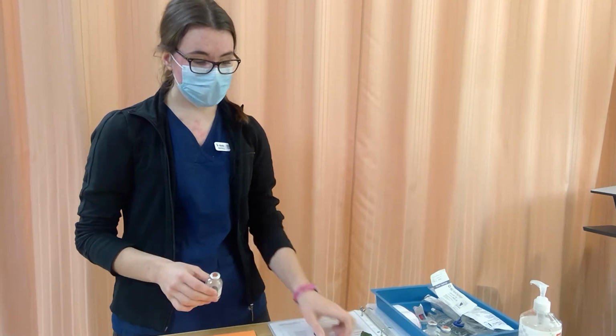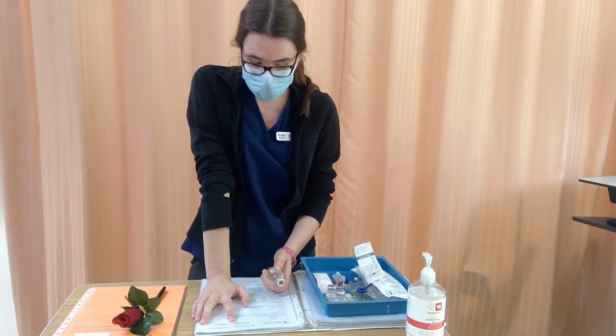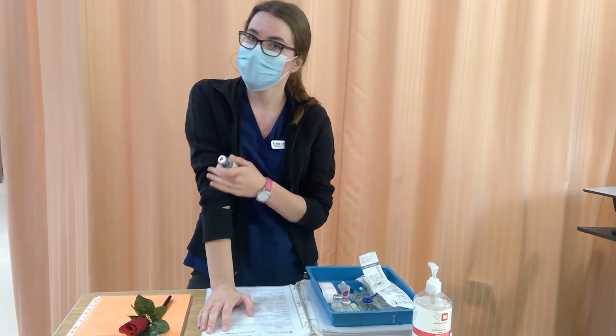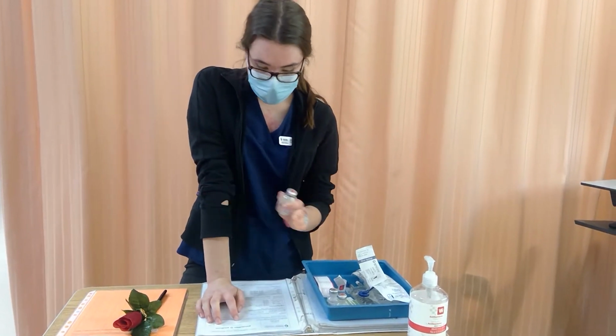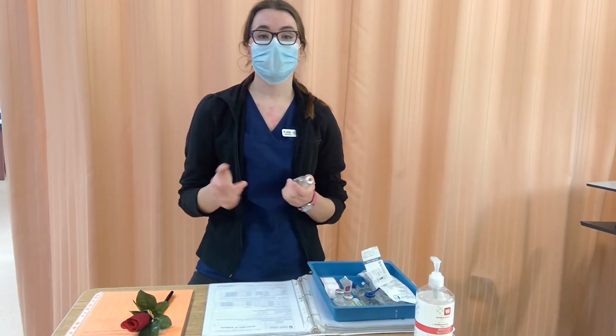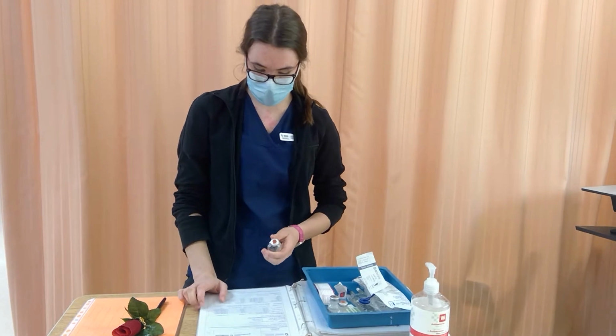We're going to be giving this via mini bag, so I'm going to check my PDM. I see that we have penicillin G sodium. It is an antibiotic, like I said, to treat that infection that he has on his arm. It can be given by a student nurse, so I'm all good. A usual dose is 2 to 4 million units every 4 to 6 hours, and we're giving 2.5 every 6 hours, so we're good, and IV is a normal route.